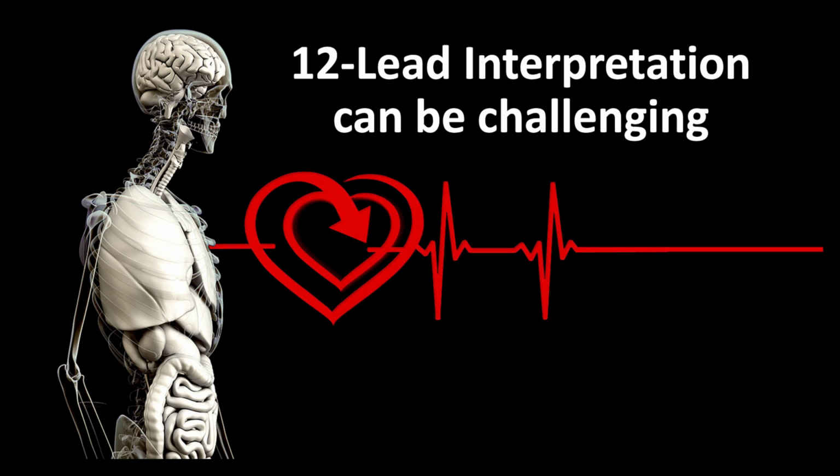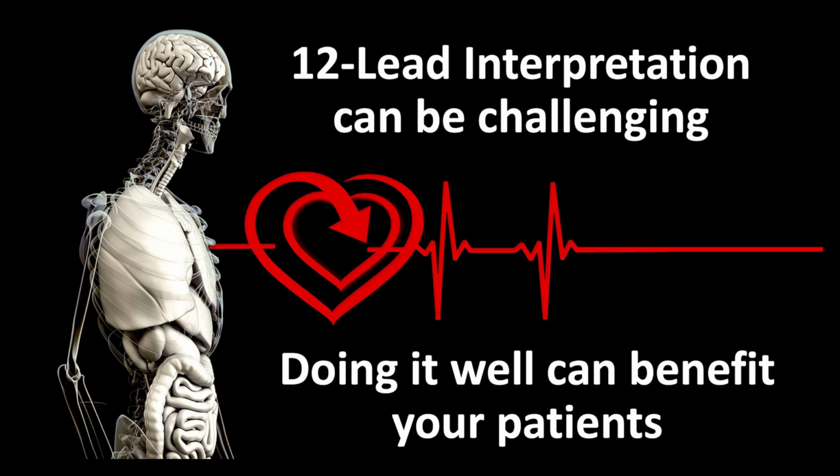Kind of the take-home message is 12-lead interpretation can be challenging. I think it's worth our effort, because it can make a significant difference in our patient's outcome.